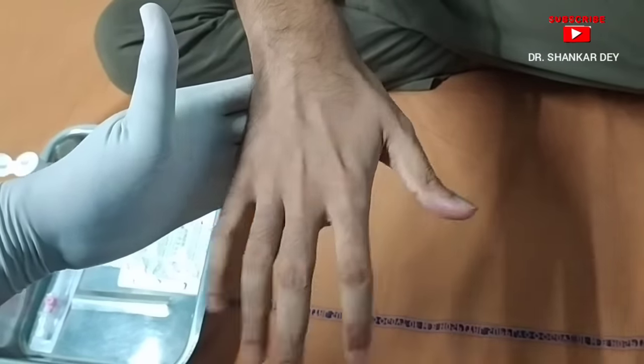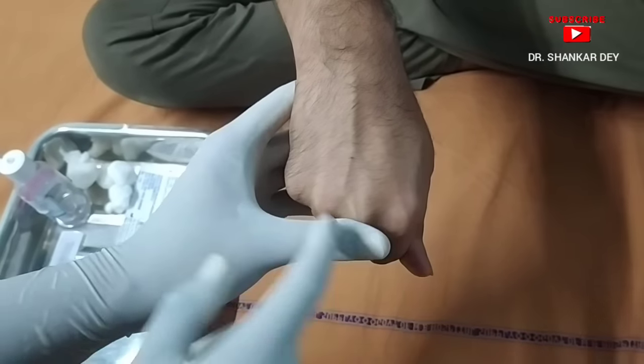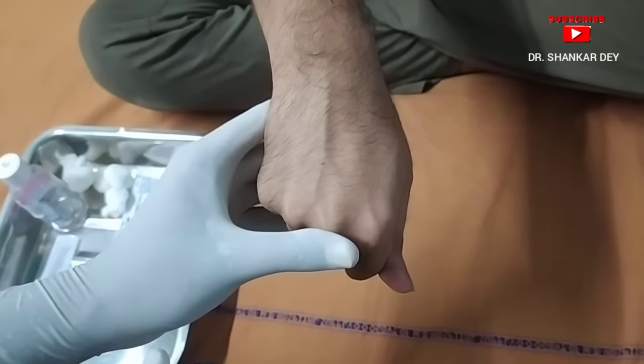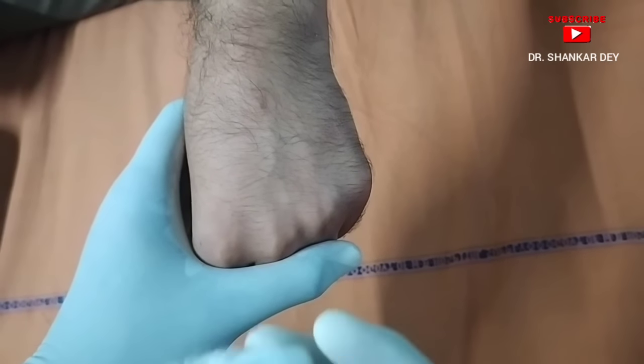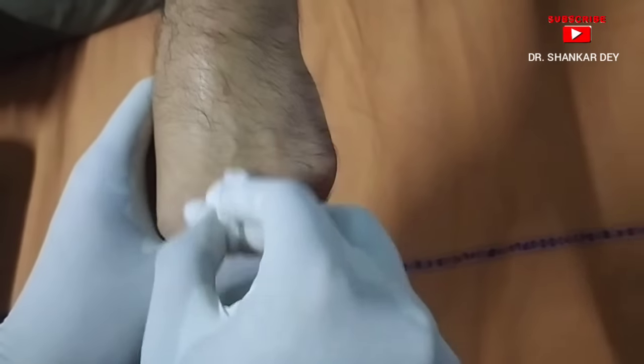Open and close. Now close your hand. See — here is one prominent superficial vein. In this vein I am going to insert the cannula. Next step: clean the IV cannula insertion site using alcohol-soaked or spirit-soaked cotton. Clean the area properly before IV cannula insertion.